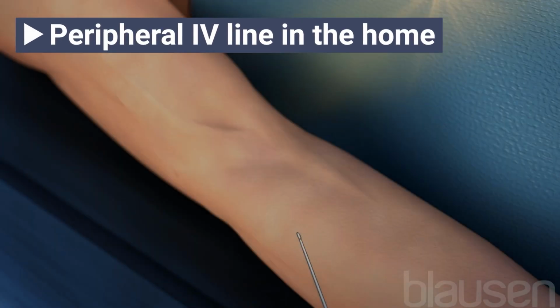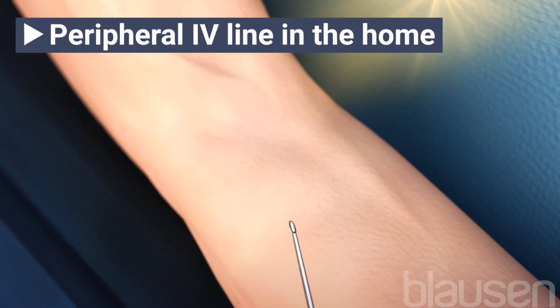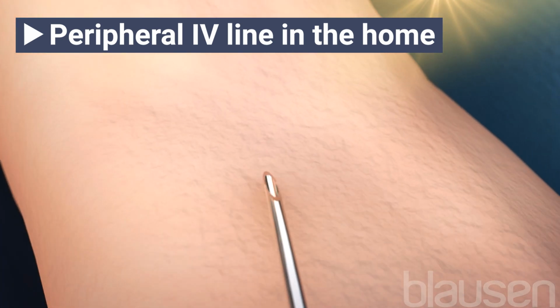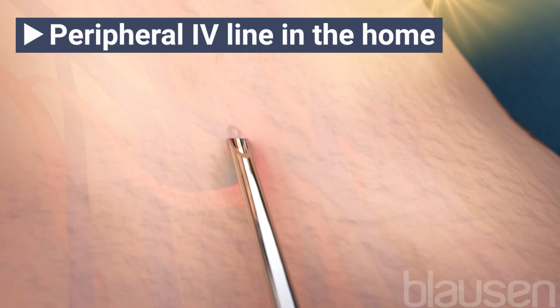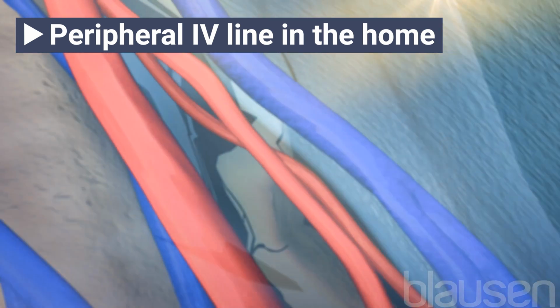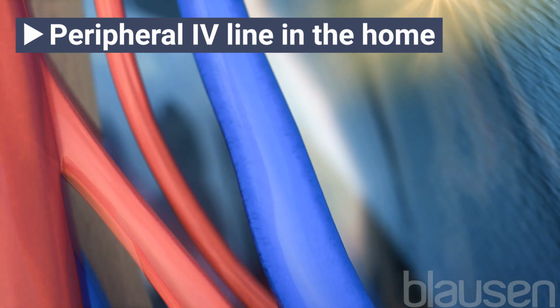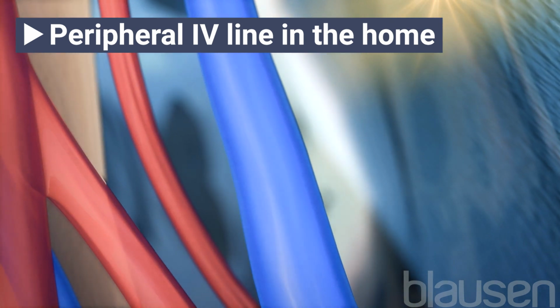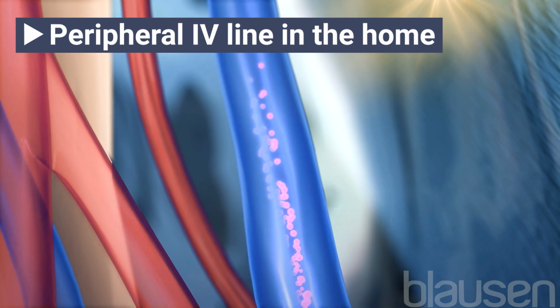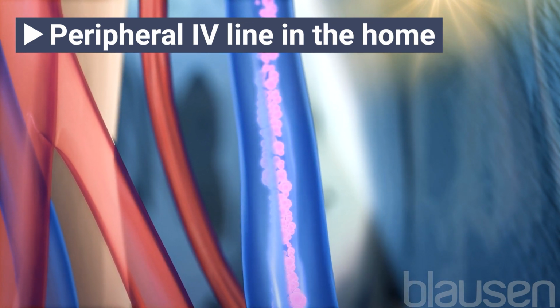Some patients may have a peripheral IV line in the home. Peripheral IVs are frequently used in hospitals, emergency departments, surgical centers, and clinics. They are very short and may be easy to place at the bedside and even in the home. These peripheral IVs typically are placed on the hands or arms. Peripheral IVs are only intended to stay in place for a brief period of time, such as a few days to a week. Also, not all medications can be put into a peripheral IV. For these reasons, not all patients can use peripheral IVs in the home.